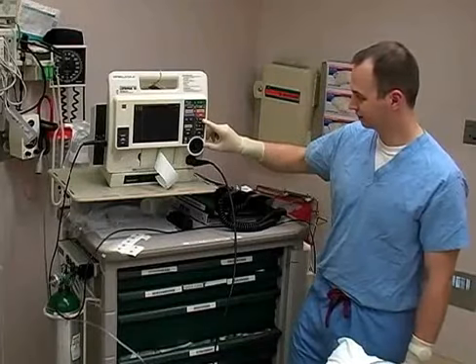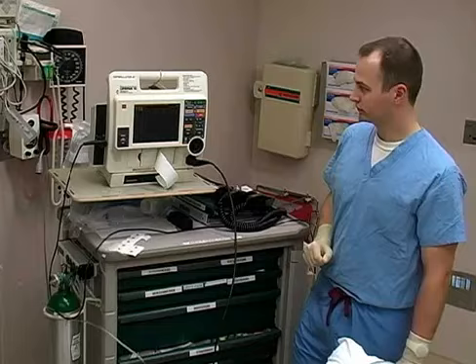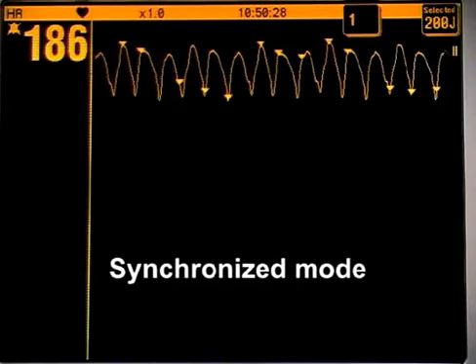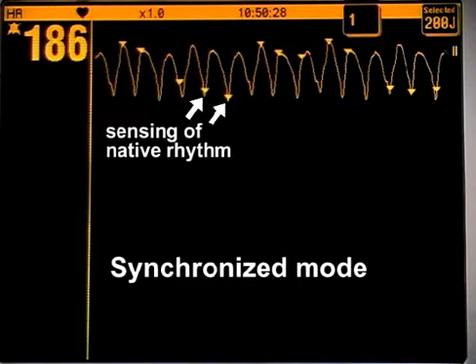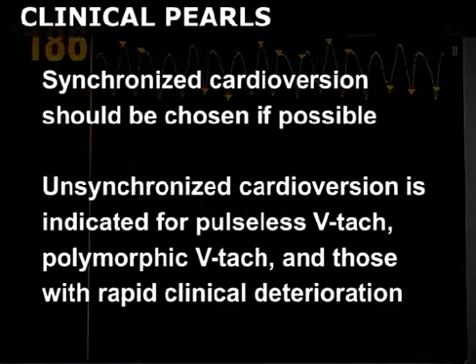At this point, you must decide whether to use synchronized or unsynchronized kardiyoversiyon. In synchronized mode, the machine senses the patient's native rhythm and only discharges the electric current after a preset time delay following a QRS complex. This prevents shock delivery during myocardial repolarization, which, if it occurs, may lead to ventricular fibrillation. Synchronized kardiyoversiyon should be chosen if possible.